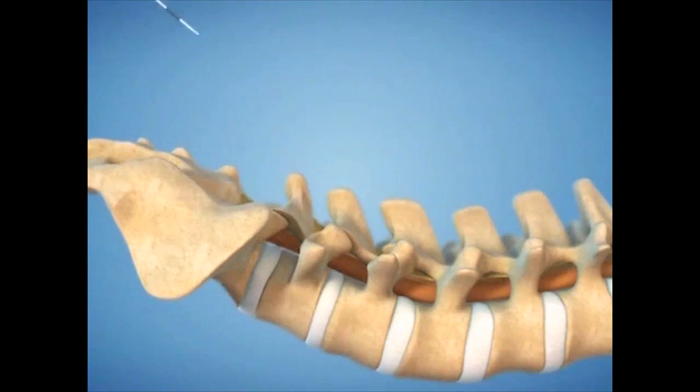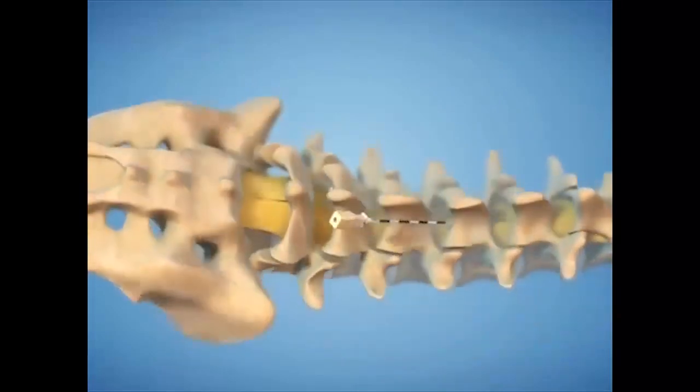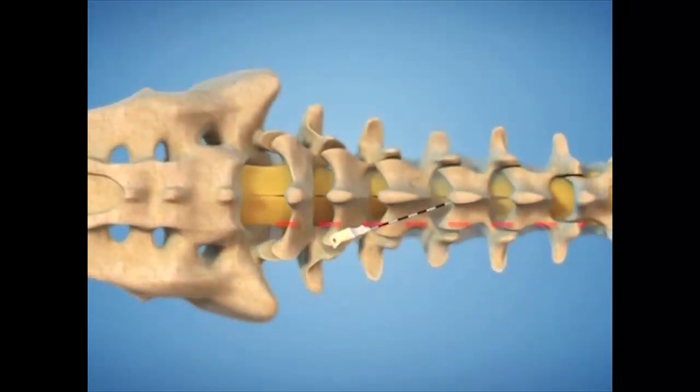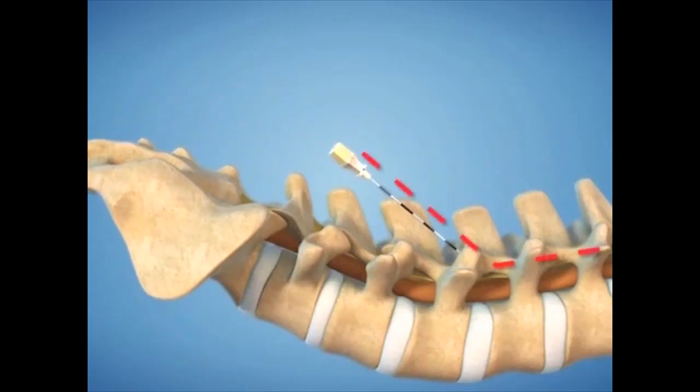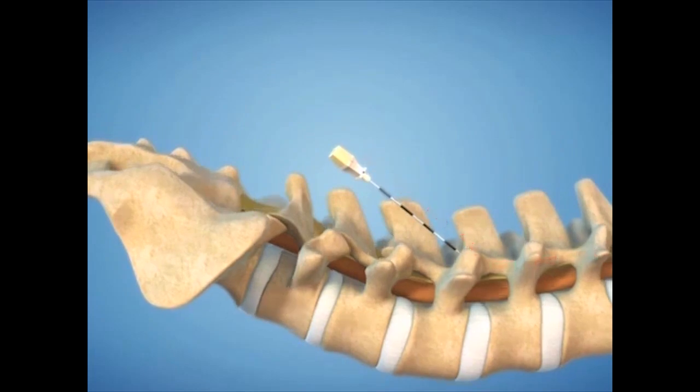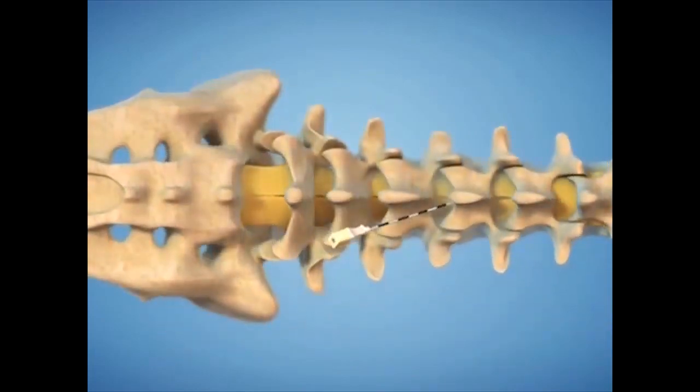A paramedian oblique needle placement technique offers several advantages over the midline technique. With a paramedian oblique placement, the site of needle entry through the skin is lateral to the spinous processes. The lateral coordinate for skin entry is parallel to the vertebral pedicle, approximately 1 to 2 centimeters off of midline. Entry is 1 to 1 1/2 vertebral levels below the interlaminar space through which the needle will pass, creating a shallow entry angle. The imaging target for the needle tip is the midline of the selected interlaminar space.